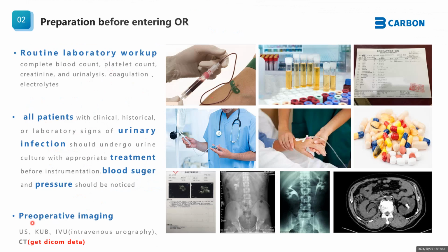Yeah, the imaging for the PCNL. In clinical practice, the doctor takes ultrasound, KUB or IVP, IVU, or CT scan exams for the patients.